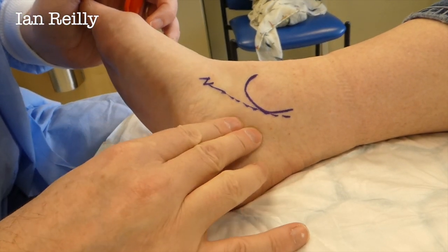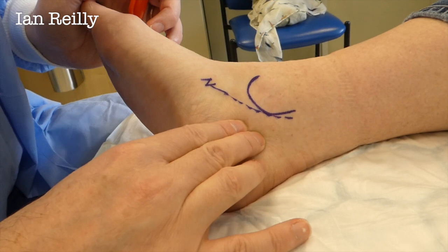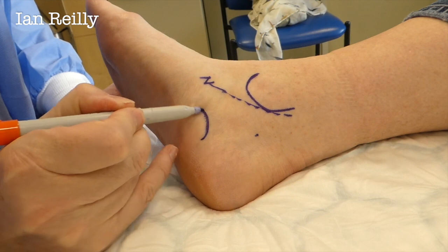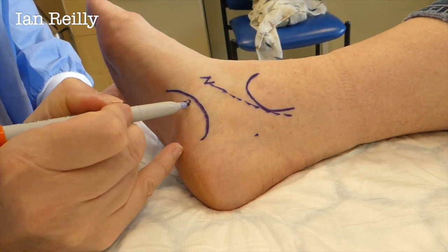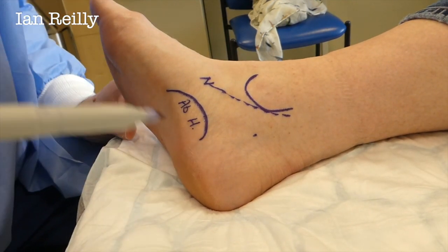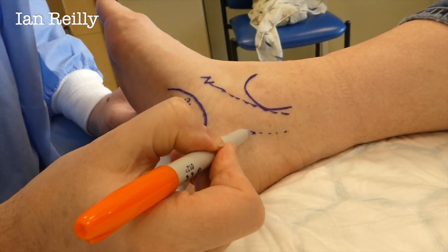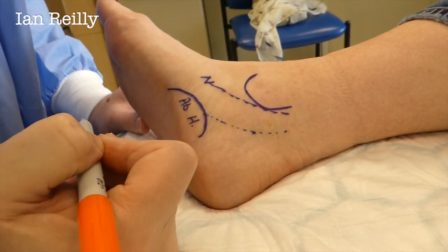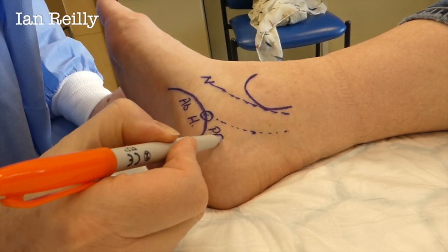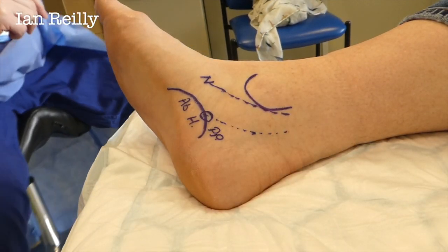Let me just feel for where your pulse is, Rita. There's your pulse there. So there's a pulse point here, and here is your abductor hallucis. Your artery is coming down and entering the foot at about that point, and at this point here we call that the portapedis.